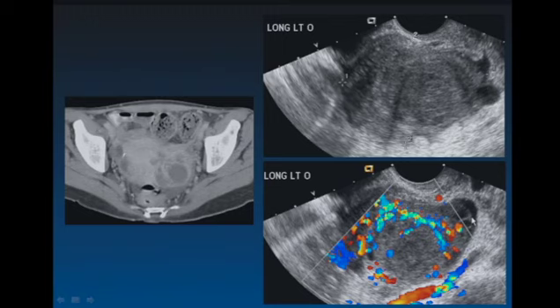So ultrasound clearly can show these findings, and ultrasound is the right first test to do in these patients. But once a CT has been done and the diagnosis is fairly well established clinically, I don't believe that ultrasound adds any value.